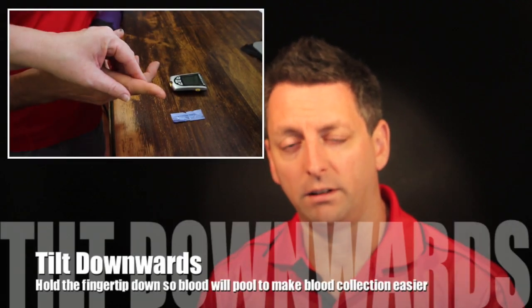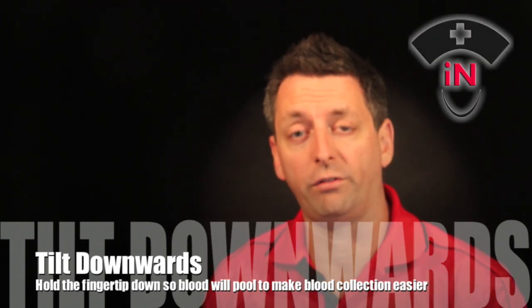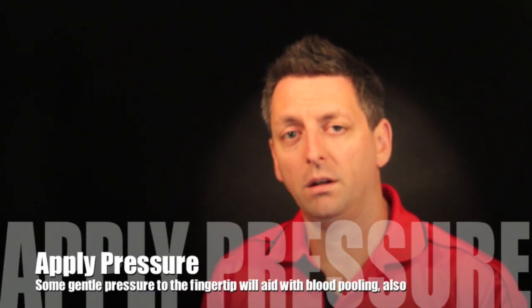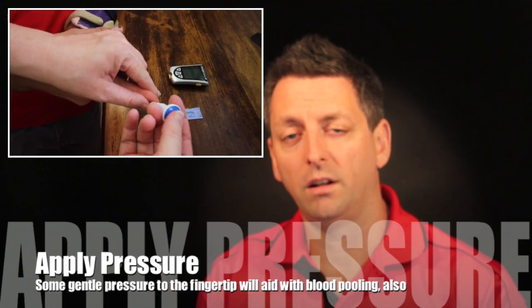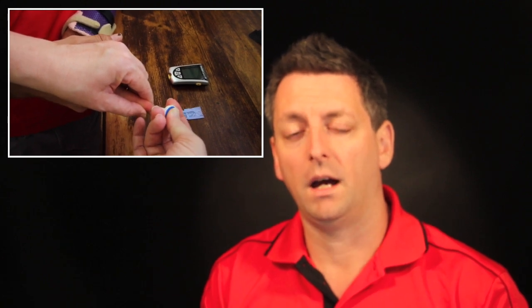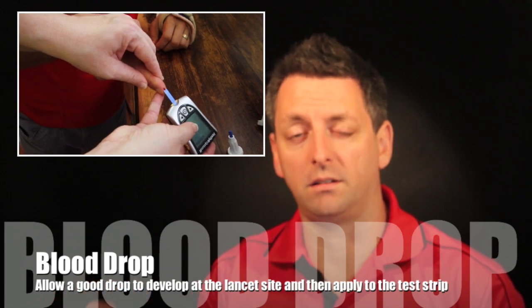What we try and do is hold the finger down so the blood runs down to it. After you've cleaned it, hold the finger down. Apply gentle pressure on the fingertip — not too hard — so that when you put the lancet on the side and press the button, you get a good spurt of blood straight away. Wait for enough blood to come out, then put up your test strip — capillary pressure will suck it up into the testing strip.